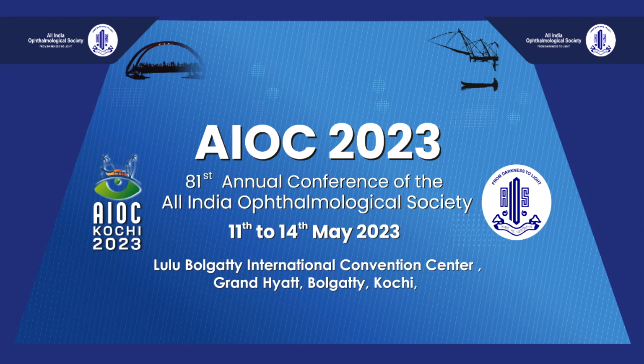Because we have time, let's start. Peripheral ischemia and non-resolving diabetic macular edema. There have been varying reports in different studies, isn't it? So can we really come to a conclusion regarding the same? If you see a non-responding edema and you see peripheral capillary non-perfusion areas, we try to laser. But does that really help? I had done it in a couple of cases, and it wasn't that beneficial.